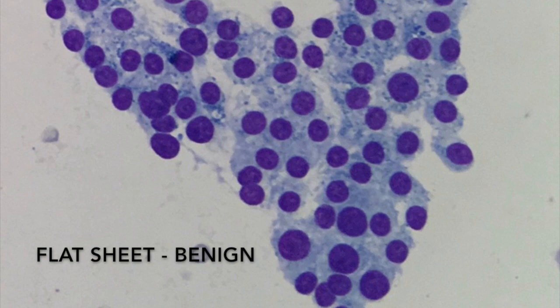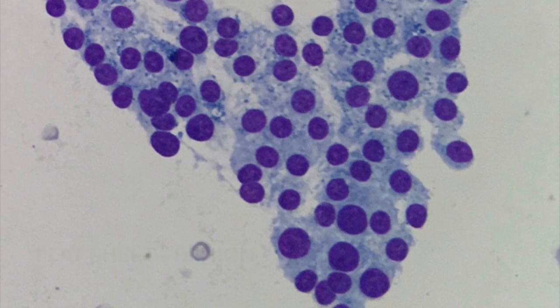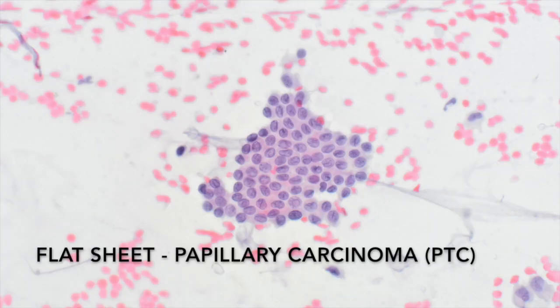Generally, thyroid FNAs show flat, regular sheets, which are usually signs of macrofollicular architecture. This is what you'll mostly find in benign thyroid nodules. Sometimes these sheets will have a stretched-out appearance, as in this example of cyst lining cells. Flat sheets can also be found in carcinomas, as in this case of a papillary thyroid carcinoma.